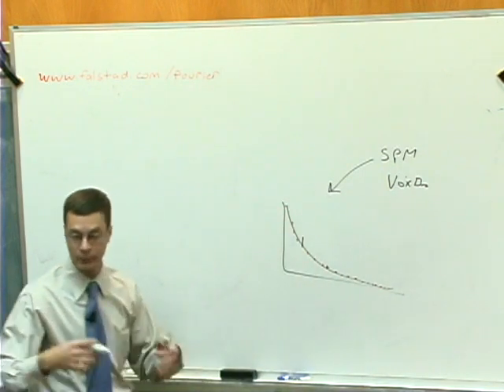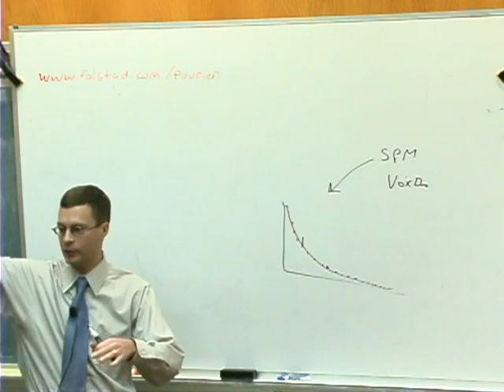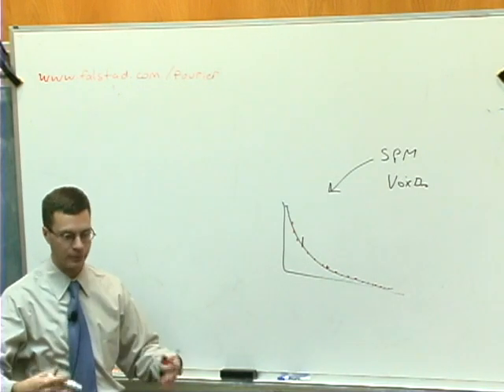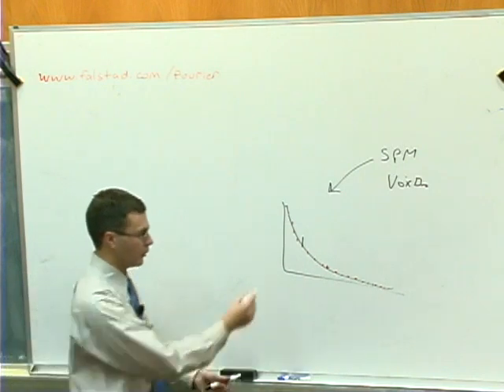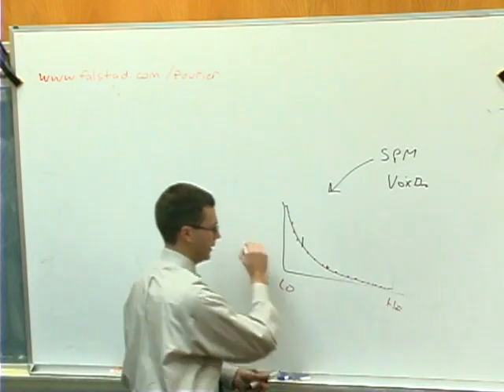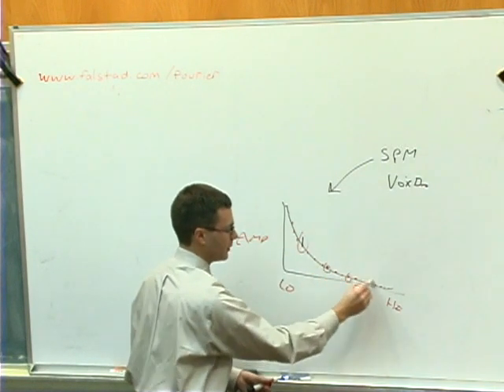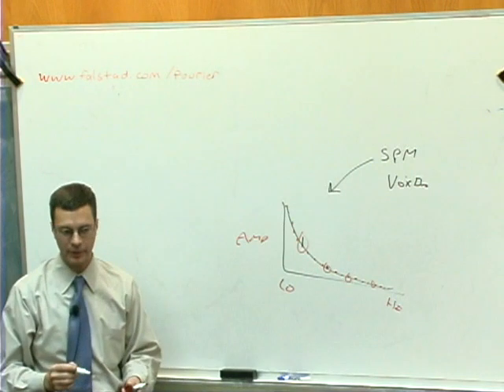Now you flash light, so that increases neuronal activity in visual areas, and then decreases it, and increases it, and decreases it. That's going to produce a fluctuation in the BOLD fMRI signal, which is reflected in this power spectrum. This is a power spectrum again: low to high frequency, amplitude. And so these are basically the effect of your task. Is everybody with me on that? Anyone have a question about that?